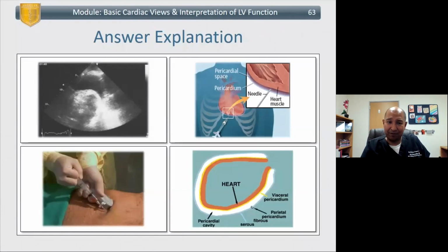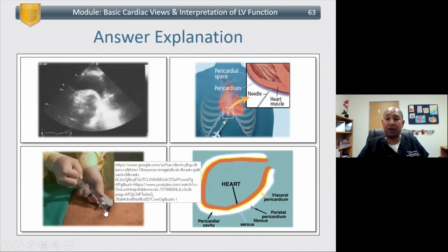And I guess let's do a follow-up question. I couldn't resist this one. What do I see over here? This is going to be a pericardial effusion. This patient had tamponade physiology. This is someone trying to do a pericardiocentesis. Usually we do it ultrasound guided.